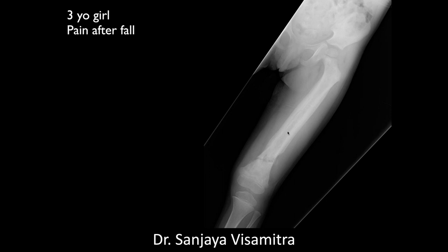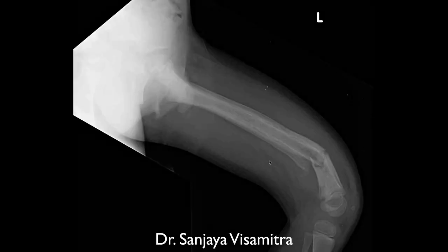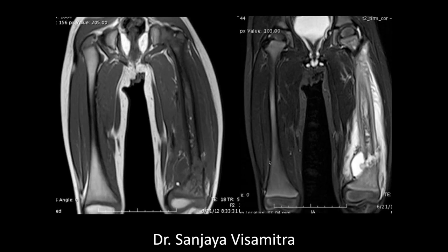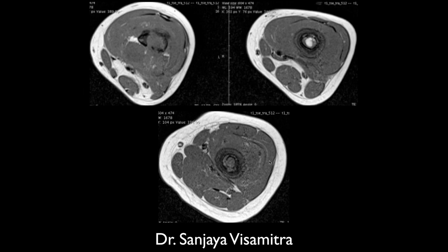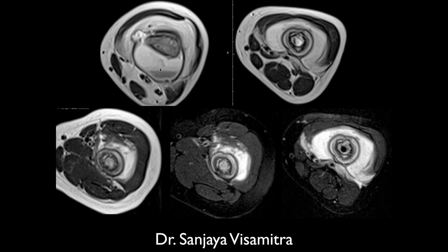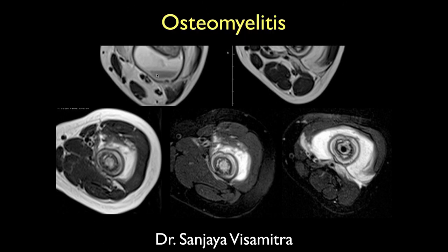A three-year-old girl with pain after a fall. There is extensive periosteal reaction and a distal femur fracture that is not healing well, with fluid and edema within the soft tissues and bone. This looks like osteomyelitis after fracture — or more precisely, chronic osteomyelitis with periosteal reaction that then led to a pathologic fracture.